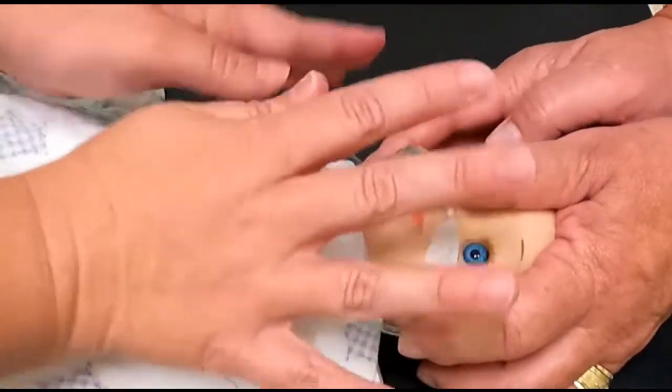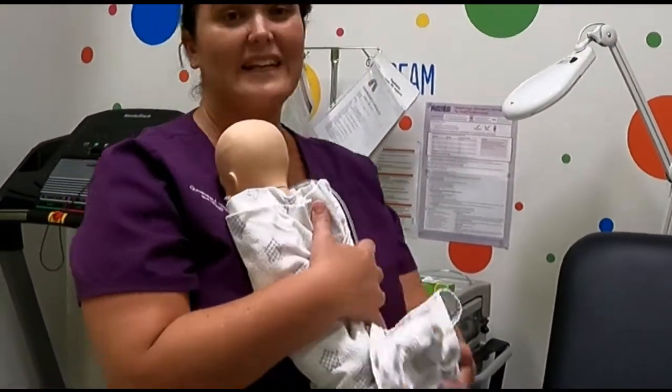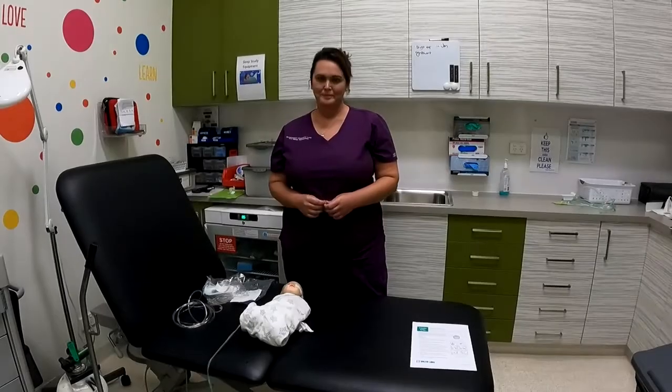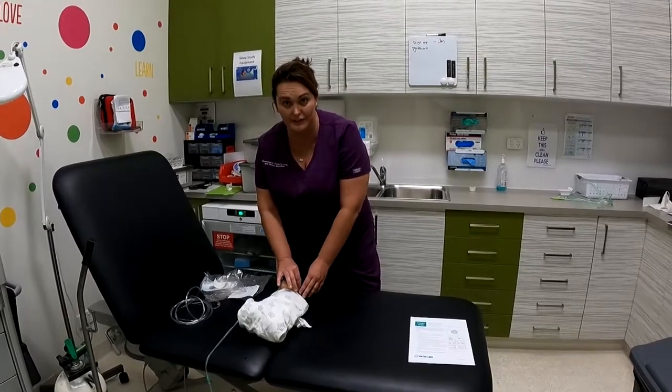And that's all done. Again, make sure, big cuddles for baby because they're probably going to be crying at this point, but make sure everything's connected and your oxygen's turned on to the amount that it's supposed to be. So those are just a couple of options on how you tape your oxygen in.